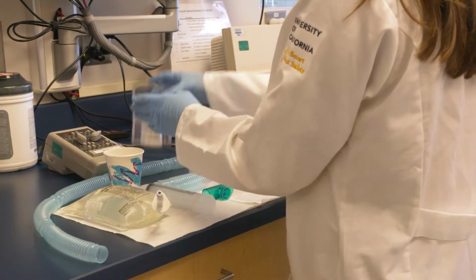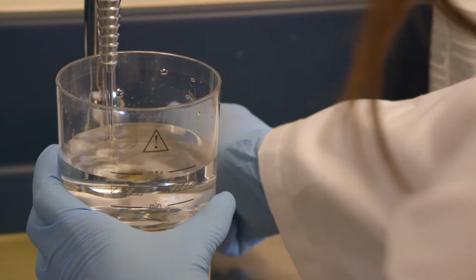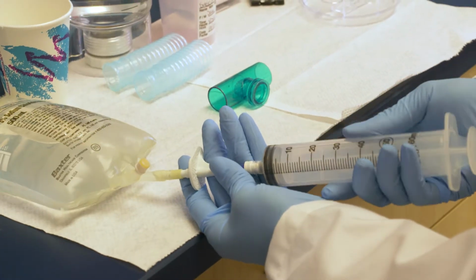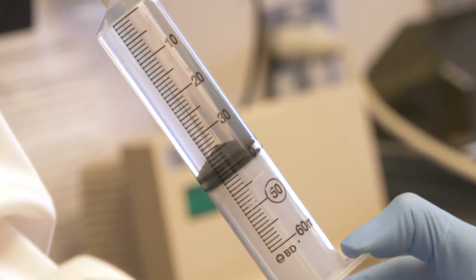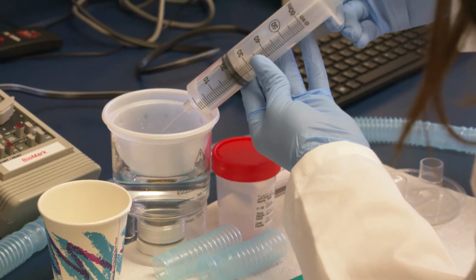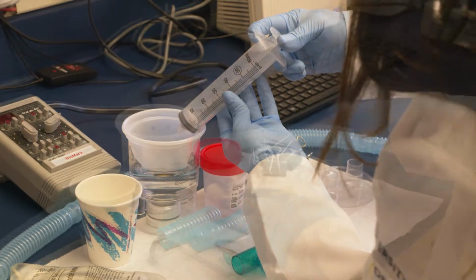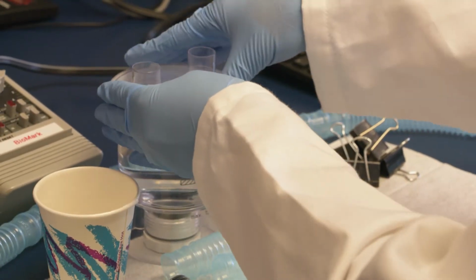Fill the nebulizer chamber to the indicated line with distilled water. Draw up and add the desired amount of saline solution as determined by your specific study protocol to the medication cup. The concentration of saline and amount may vary, so refer to your protocol for specific instructions. For this induction, we'll be drawing up 40 milliliters of hypertonic saline.